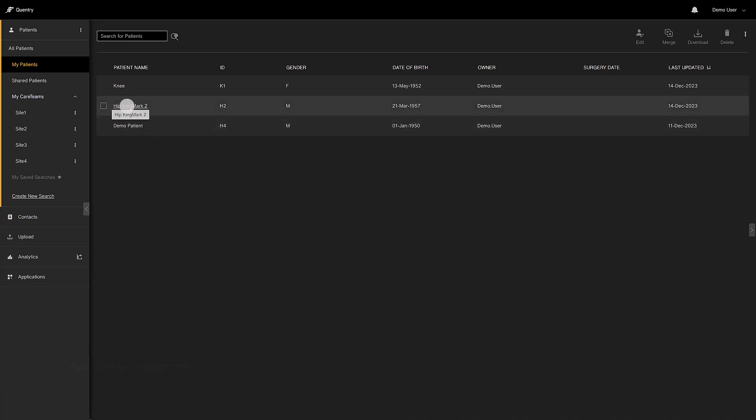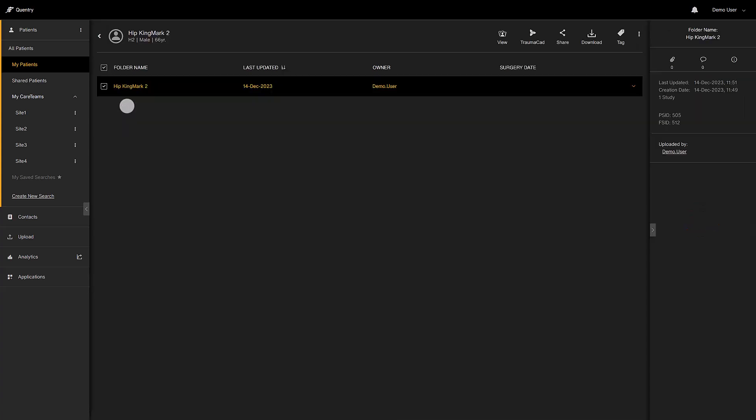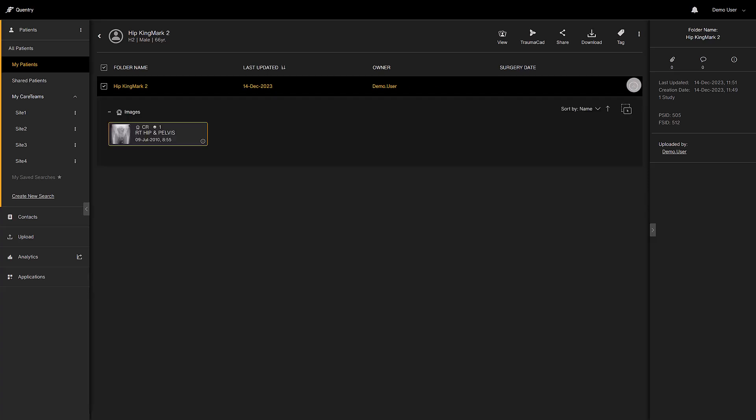You can then inspect all images that are available for this patient. You can check what images you have by opening the folder. There's only one preoperative image, so it's automatically selected.